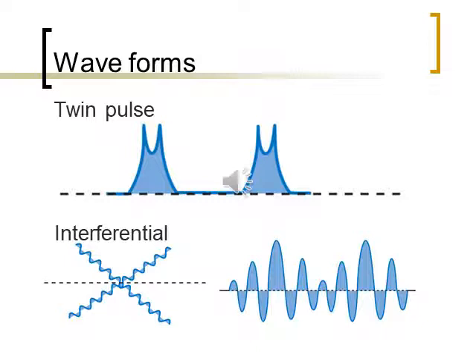Now it uses a sinusoidal current to create it, and then it creates this effect where you get in between the electrodes an electrical charge that impacts that treatment area. So the IFC takes a symmetrical sinusoidal alternating current and basically uses two of them to create the effect for your interferential current.